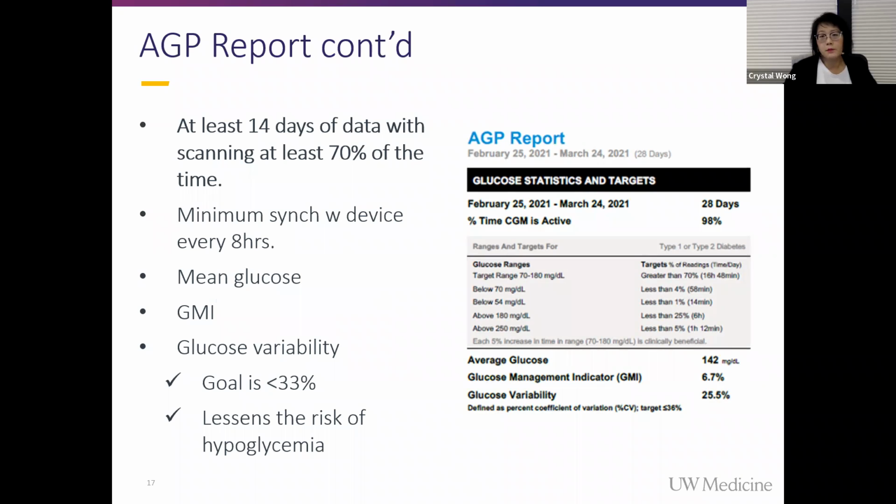Yeah. So self-pay, completely cash, is $70 for 2 sensors. And I know this because I've had patients go and buy them themselves. Usually you can get a coupon. I think one of my patients was able to get a coupon from the LibreView website to bring the cost down to $50 out of pocket.